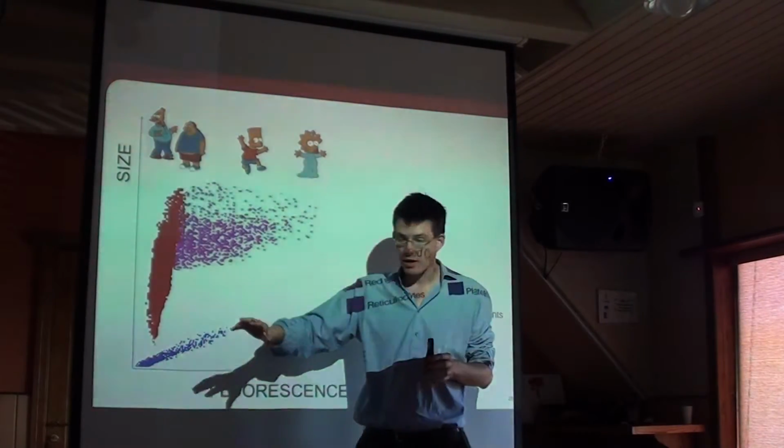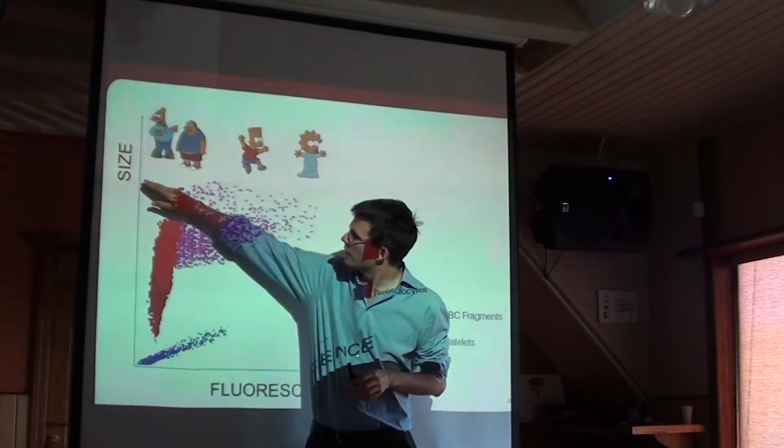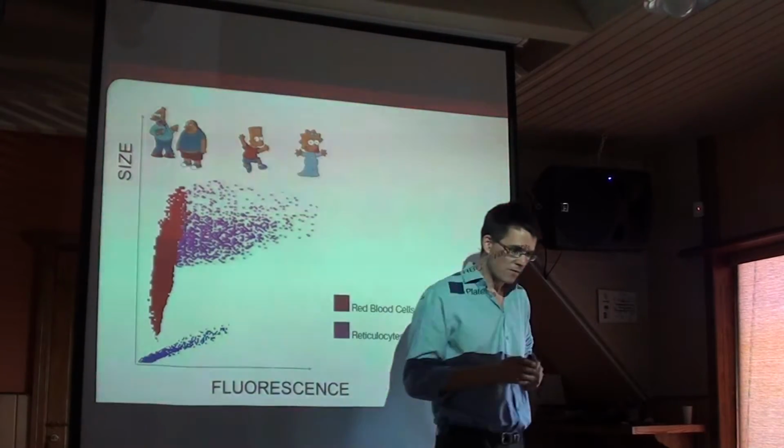On this particular analyzer, and this could be any analyzer, we have size on the vertical axis.